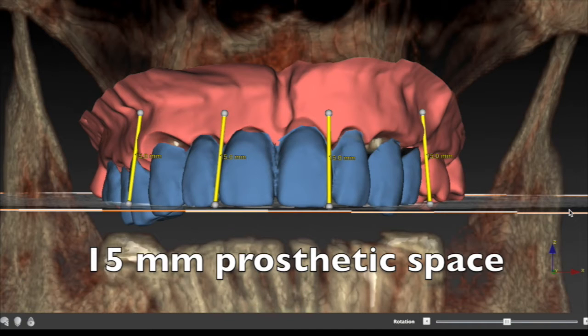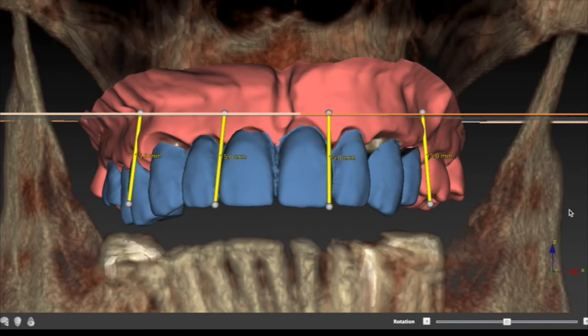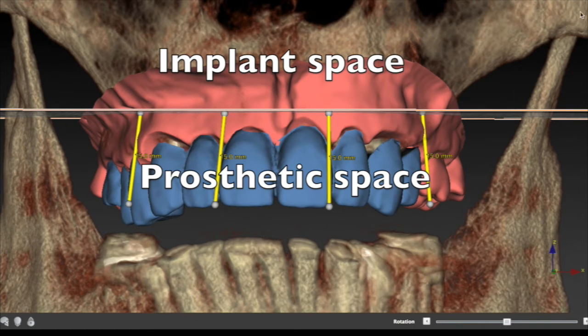Once we have this occlusal plane mapped out in the software, we can measure up 15 millimeters and this is where the start of the implants could be placed. If you're choosing a deeper space then it could be higher. Keep in mind that the higher you go when angling implants next to the sinus, the more you're going to minimize your AP spread. As we move this occlusal plane up you'll notice this is where we want the head of the implants. So we have above what's called the implant space and below what's called the prosthetic space — we need to plan both of those spaces to be appropriate for the loads we're going to apply.